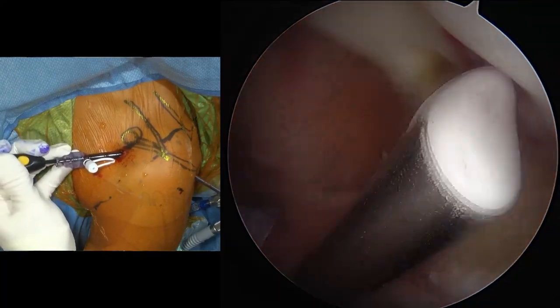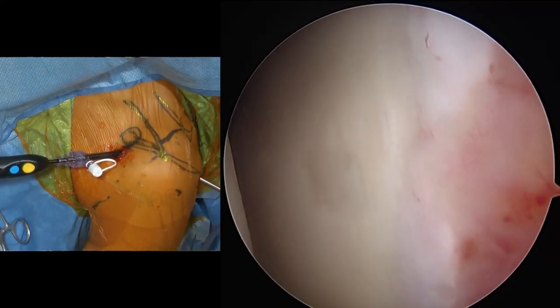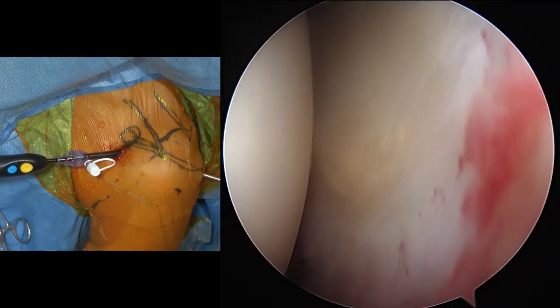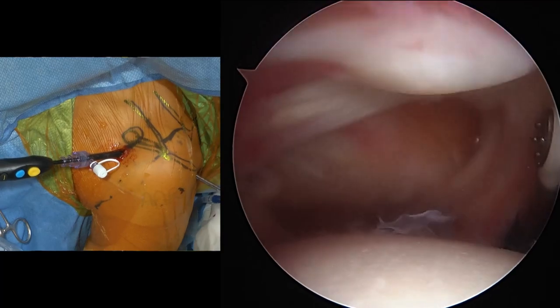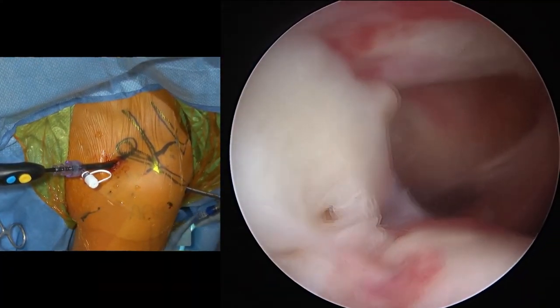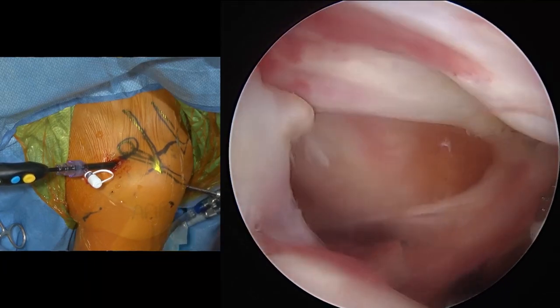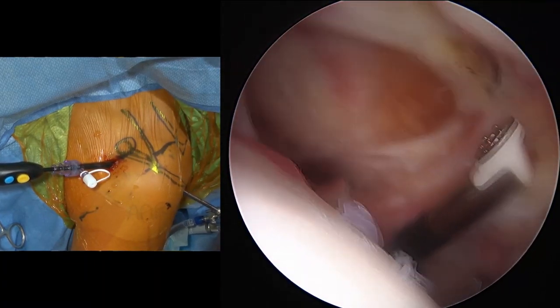Get out of the sub pretty quickly. Just looking at the back of the shoulder, that all looks pretty good. He's got a pretty good sized tear. It looks like it's progressed since the partial thickness tear that he had before, with a split in his rotator interval, as we see right there. Then take a closer look at his subscap and make sure that that's okay.